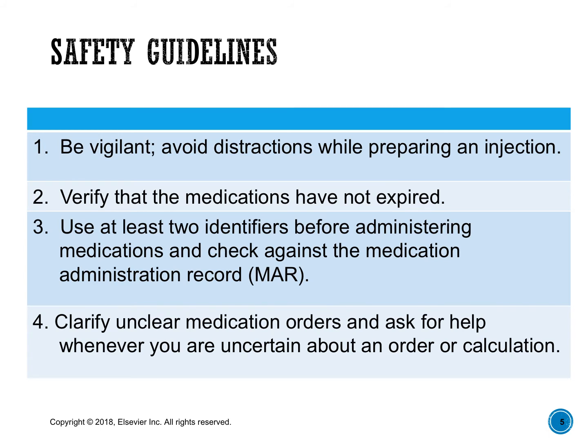Other safety guidelines, and this is a review from our content on IV management. Make sure that you're not distracted. You're in a no interruption zone when you're drawing up your medications and you're doing your calculations. It's very important. Make sure that when you're looking at your vials of medications, when you're looking at your saline flushes, they are not expired, they're within date. You're appropriately identifying your patient. You're doing those medication checks that you're supposed to do the 3 times.